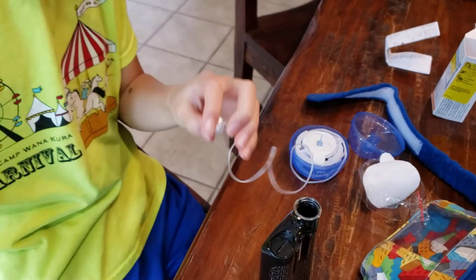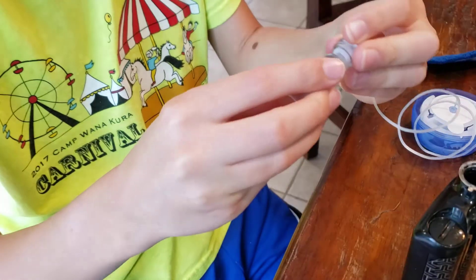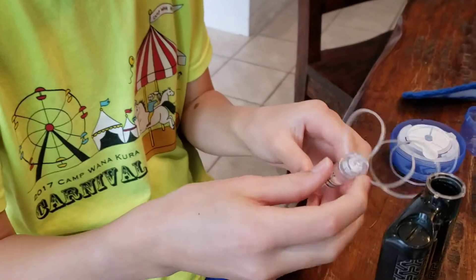And then you take this, and you connect it. And then turn and lock it, right?